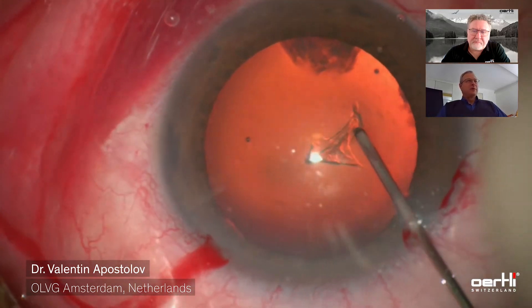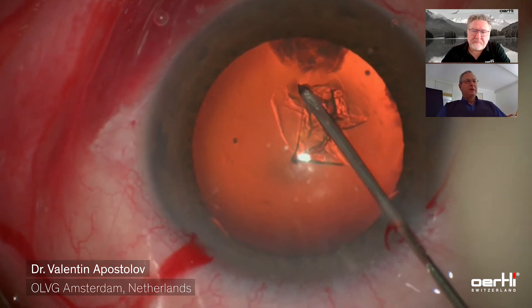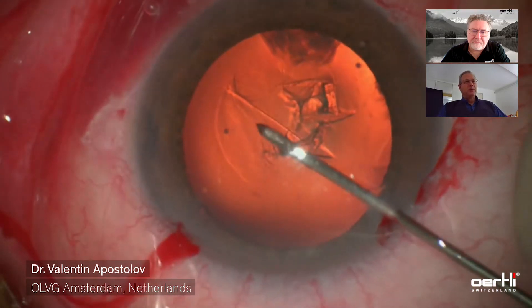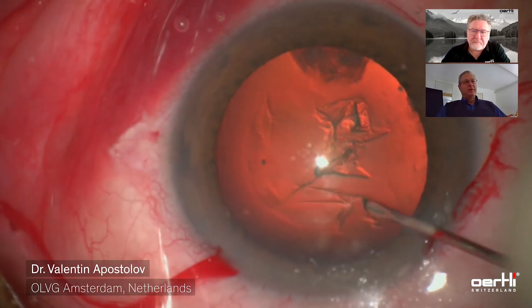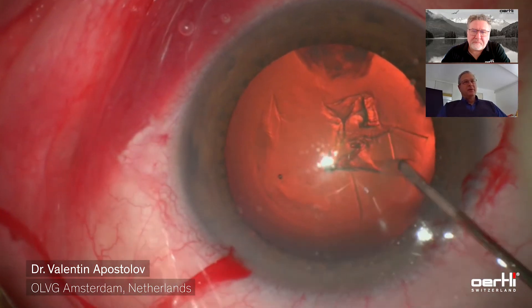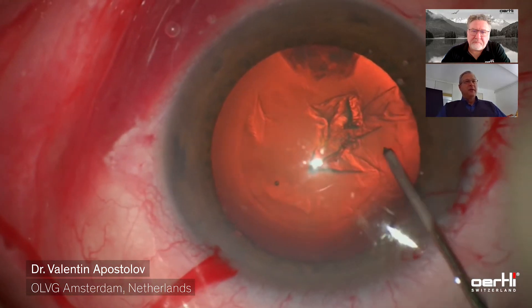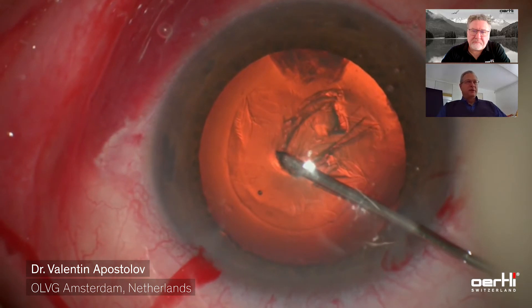That's performing the capsulorexis with the needle. If the eye is challenging — with a small pupil, a very shallow anterior chamber, or something similar — then I also use capsulorexis forceps, but mostly it's the needle. I've learned to do the capsulorexis that way and I like doing it that way.